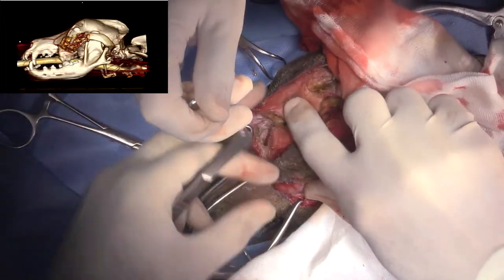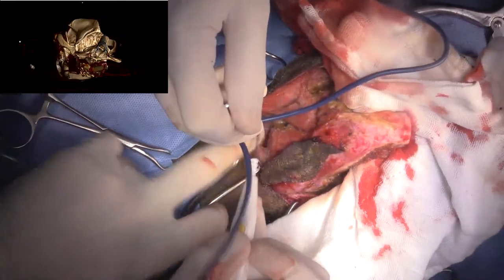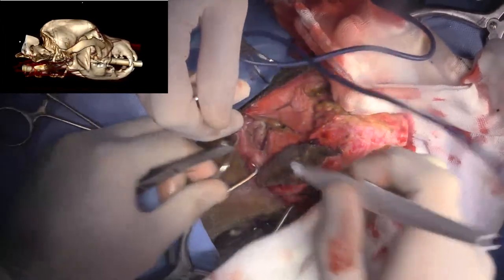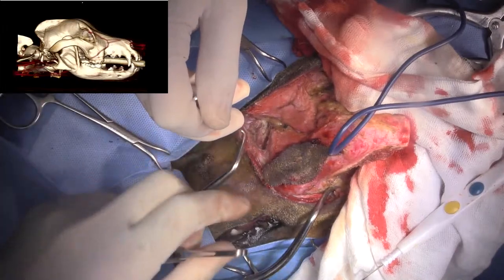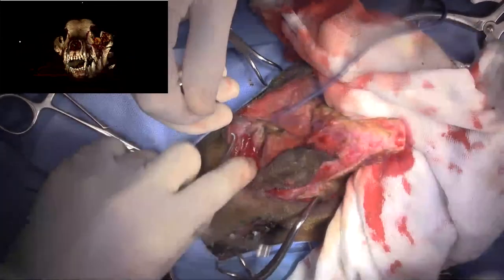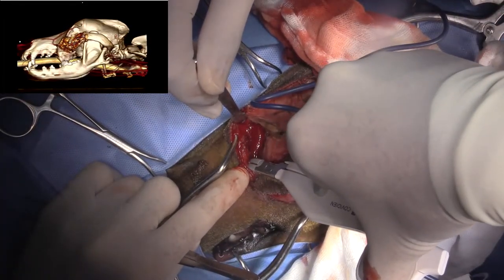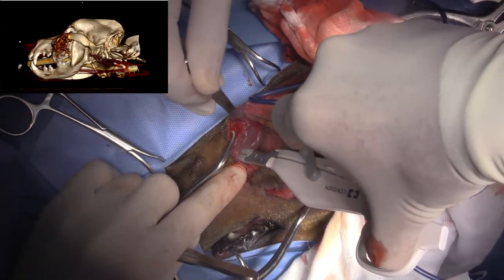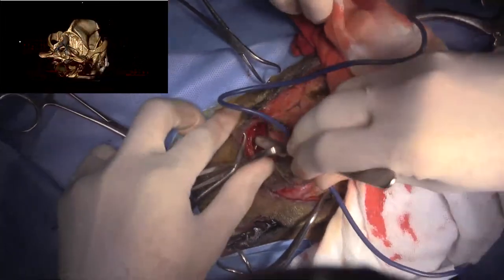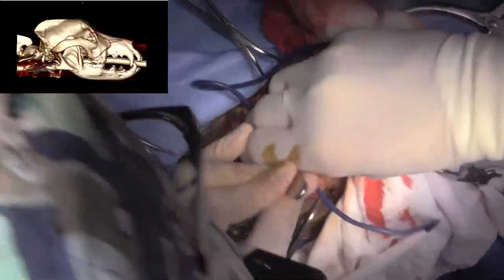So that's the conjunctiva right there from the inside. I really like surgical oncology because you see things from directions that you're not used to seeing them, and so you have to really get used to three-dimensional interpretation of the anatomy. That's the facial vein, yeah. And the skin in this area is so tightly adhered to the skull.